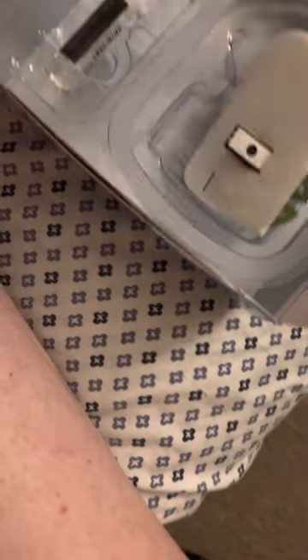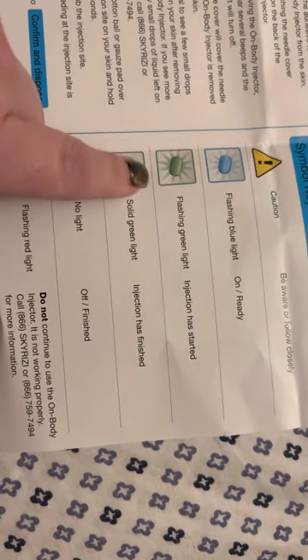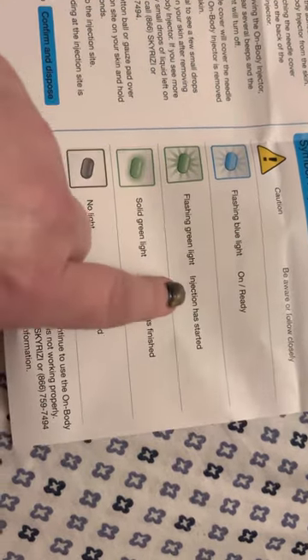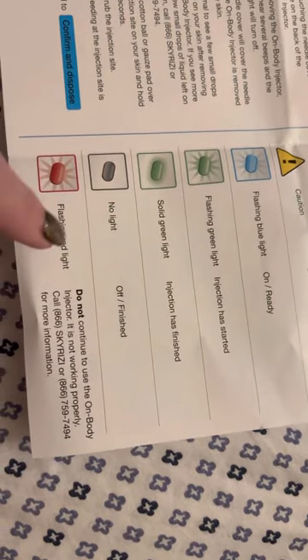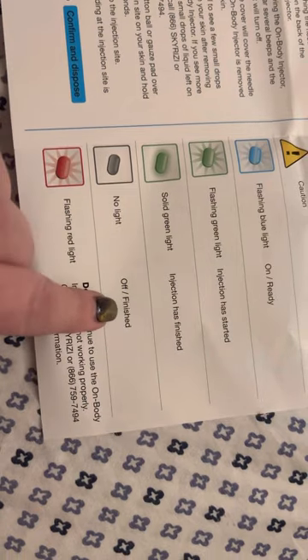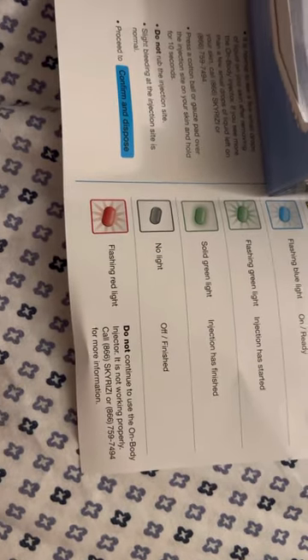You don't want the timer to start until you have the cartridge in there. Blue flashing light means it's ready. Green flashing light means the medicine has already started, so it should already be on your body when that green light is flashing. Solid green light means the injection is finished and you can peel it off your skin. Wait until the light completely goes out. If your device is flashing red, call your pharmacy or follow whatever instructions your provider gave you.